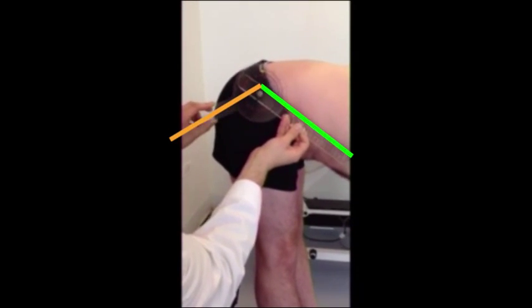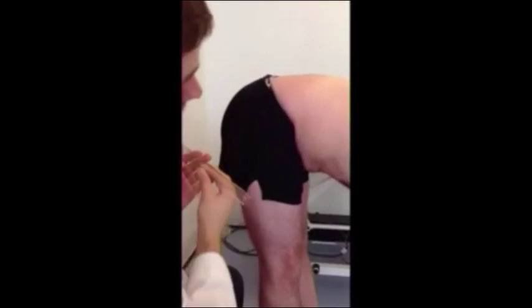Alright, so that is about 58 degrees, and that is close to normal. So that is lumbar flexion goniometry.